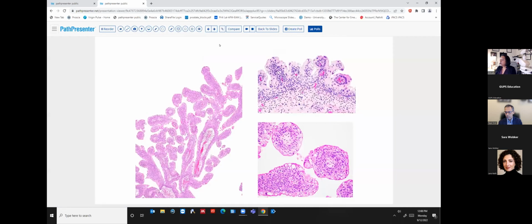Now, normal urothelium itself has a range of appearance. Here I show you 2 side-by-side sections from a papilloma, and you can see while on the top, the number of intermediate cell layers is much less, like 1 or 2 layers, some tangentially cut. The one at the bottom has multiple layers in the intermediate. So there is a range to that as well.